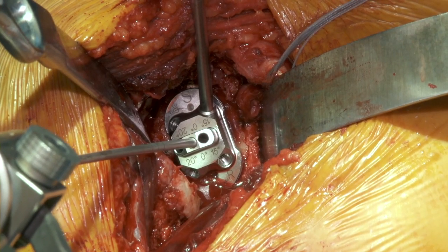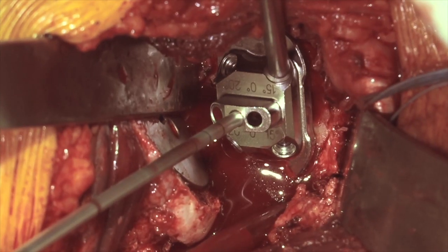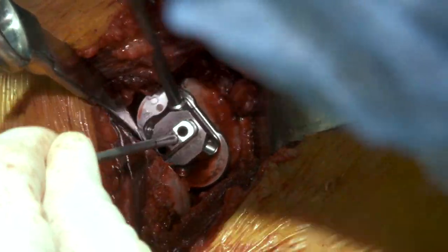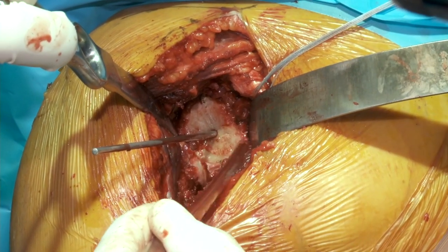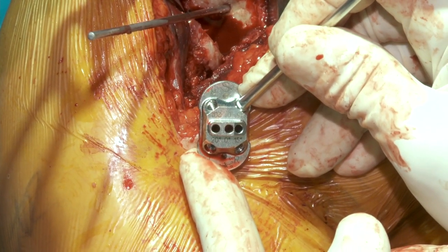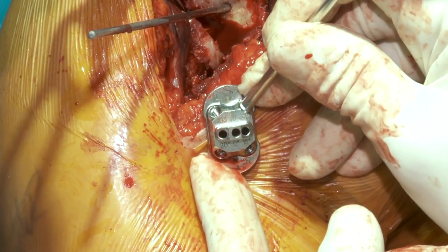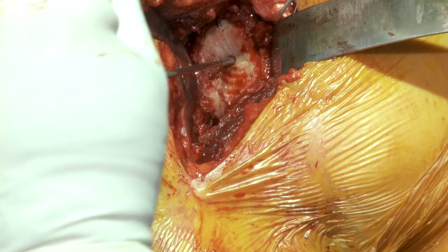We'll place this into the center, zero-degree guide position, and go down until we see the three laser lines, which tells us when we've gone through the scapular cortex. We're starting to hit hard bone, so most likely our center screw will be the 15mm — the smallest one — with options for 20mm and 25mm. We'll back out our guide, slide this out over our guide pin, and ream the face of our glenoid to prepare it for our face plate. The diameter of the inferior part of the glenoid is in a good position with a slight inferior tilt. This case is zero degrees deformity, so we're in good shape.